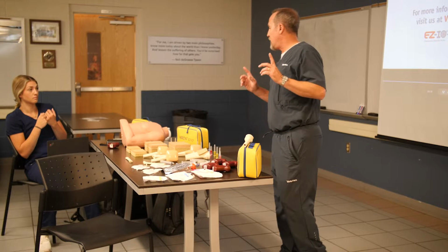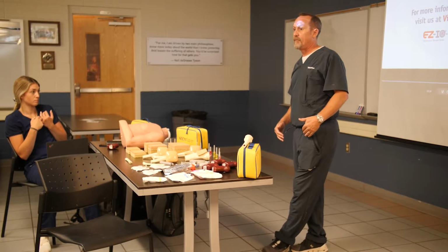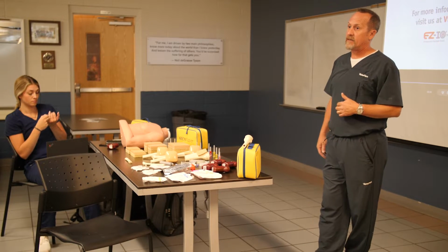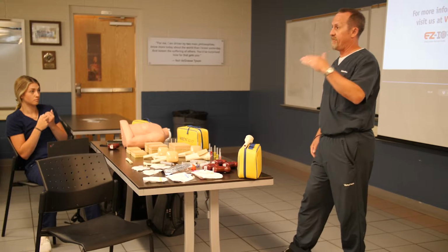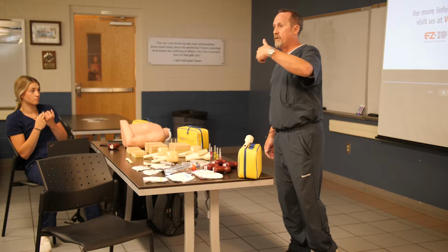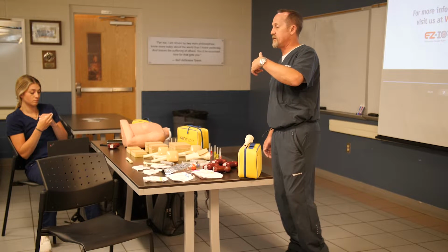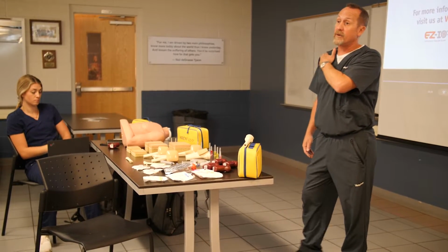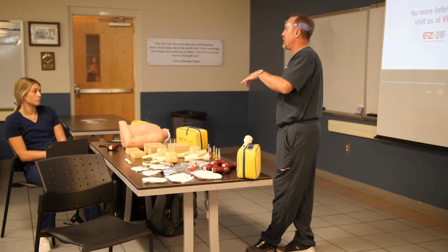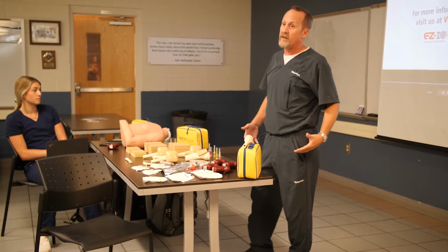So now I'm gonna go back, just wanna talk a little bit about when we place the IO into a patient. Anytime we're going into the legs, we're gonna go 90 degrees to the aspect of the bone, okay? So you're gonna find that landmark area and you're gonna drill straight in. And we're gonna drill in until we feel a loss of resistance, and we'll just stop drilling. We know we're through the cortex and into that medullary space. When we go to the proximal humerus, we're gonna follow the rule of 45s. And this is a really important thing for you guys to understand, because it's also gonna be very helpful when you have a lot of activity going on at the head of the bed.